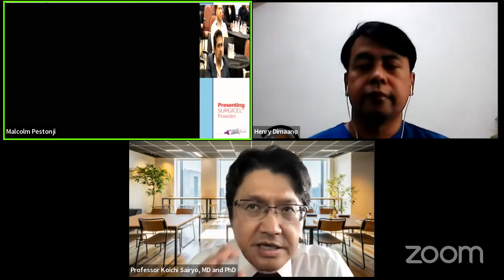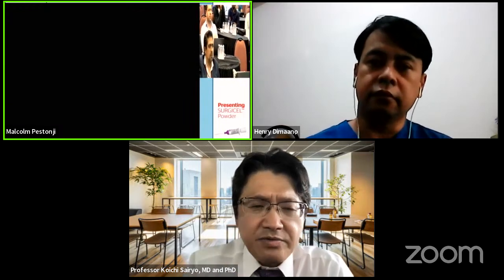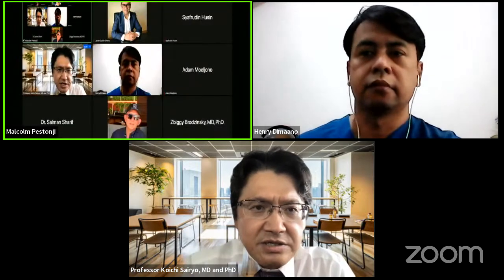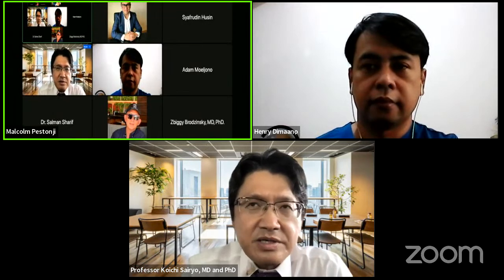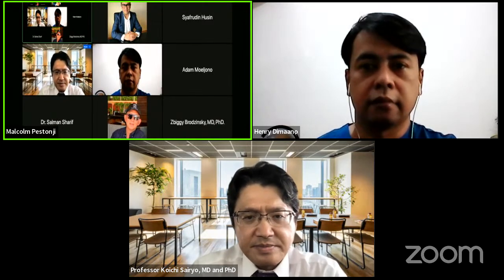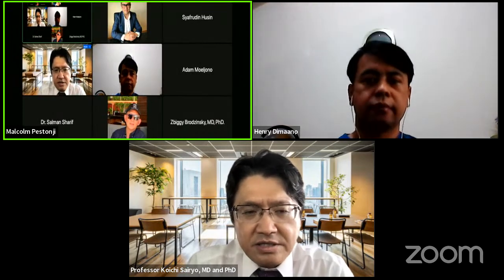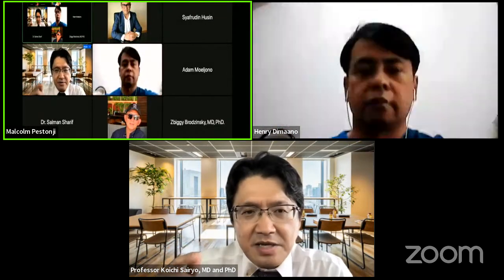Yeah, thank you so much. Actually, under a little bit of sedation, not a strong one. If I say something, the patient can answer. So a little bit of sedation, and the surgery is maximum 90 minutes. Usually possible. So can we do it with spinal epidural also? No. Just 1% lidocaine, 15 mL only.